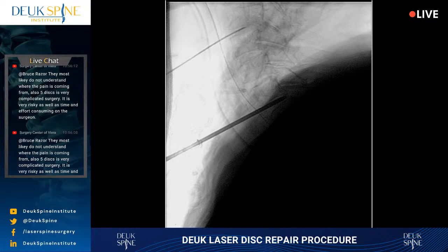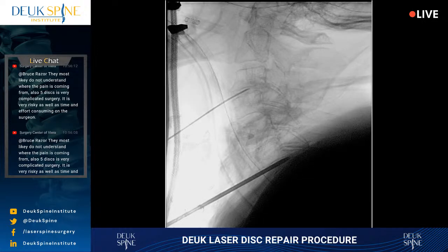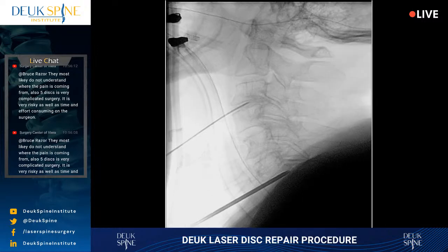So now I have to track from C6-7 disc to C5-6, and I have to do that. That's pretty good with the dilator. Just play with the wag a little. It's got to be this towel. So the towel has a little bit of contrast in it, and that's what's making it weird looking. Shot. That should take that away and make the view better. Shot. All right, that's better. So you can see the dilator. I put it back at 6-7. I'm going to pull it out of the 6-7 disc. I'm going to march it along the front of the spine, along what's called the anterior longitudinal ligament.